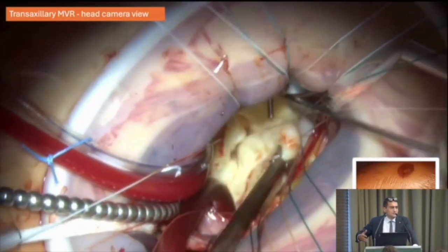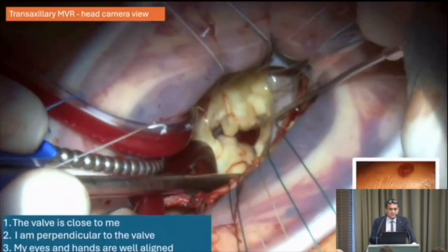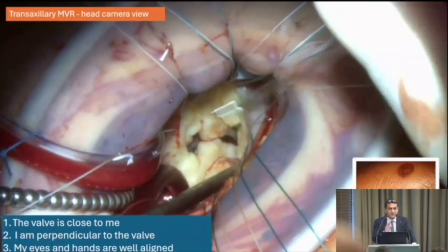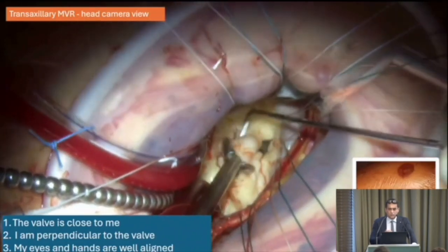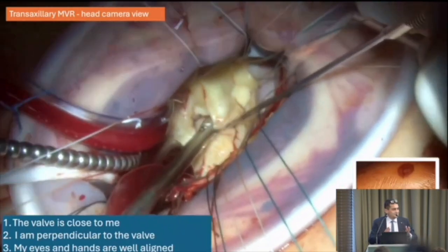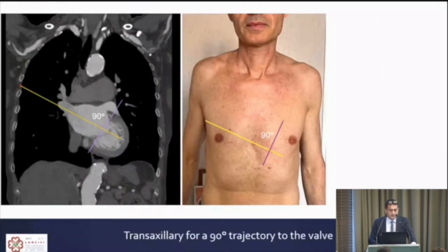It's all about where you enter the chest. If you enter laterally, you end up with very good conditions to work with direct view, without the need for any camera. The trajectory to the valve is truly perpendicular — you see all the valve segments P1, P2, P3 on the same plane. You are also very close to the valve; the distance from the chest wall to the valve is short. The ergonomics are like robotics: your eyes are in the middle, the right instrument comes from the right, and the left from the left.